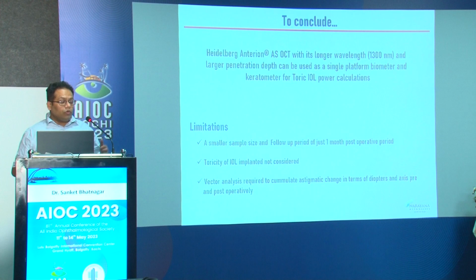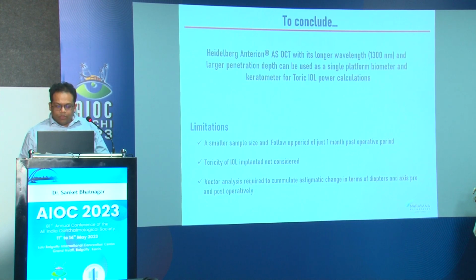Just to conclude from this study, Heidelberg Anterion with its longer wavelength and larger penetration depth can be used as a single platform biometer and keratometer for toric IOL power calculations, but this study was not without its limitations. We had a smaller sample size, and the follow-up period was only 1 month post-operative. Also, the toricity of the IOL implanted was not factored in, which can be a confounding factor. Also, vector analysis is still to be done because the sample size is a little low. So that's for the future direction. Thank you.